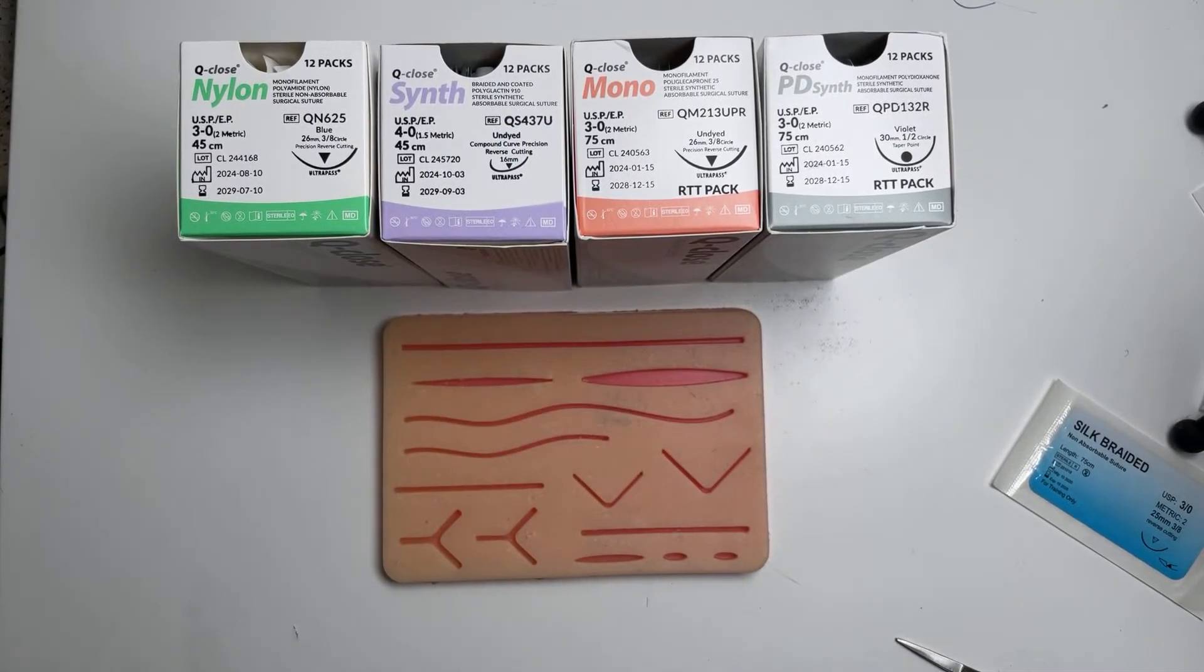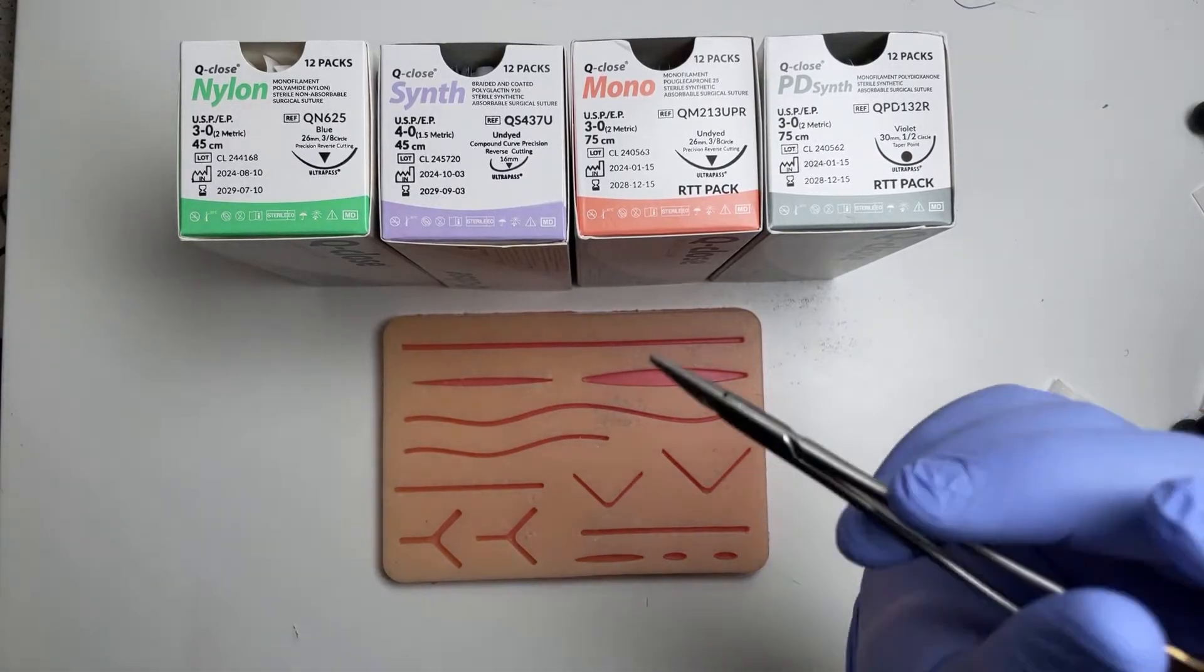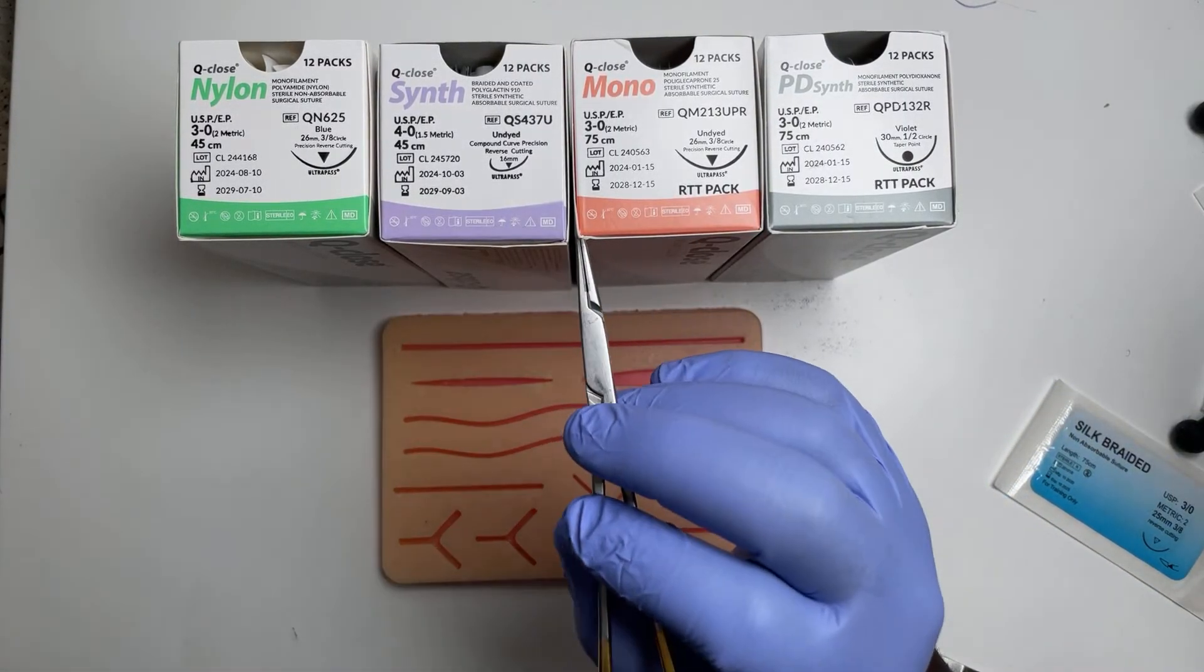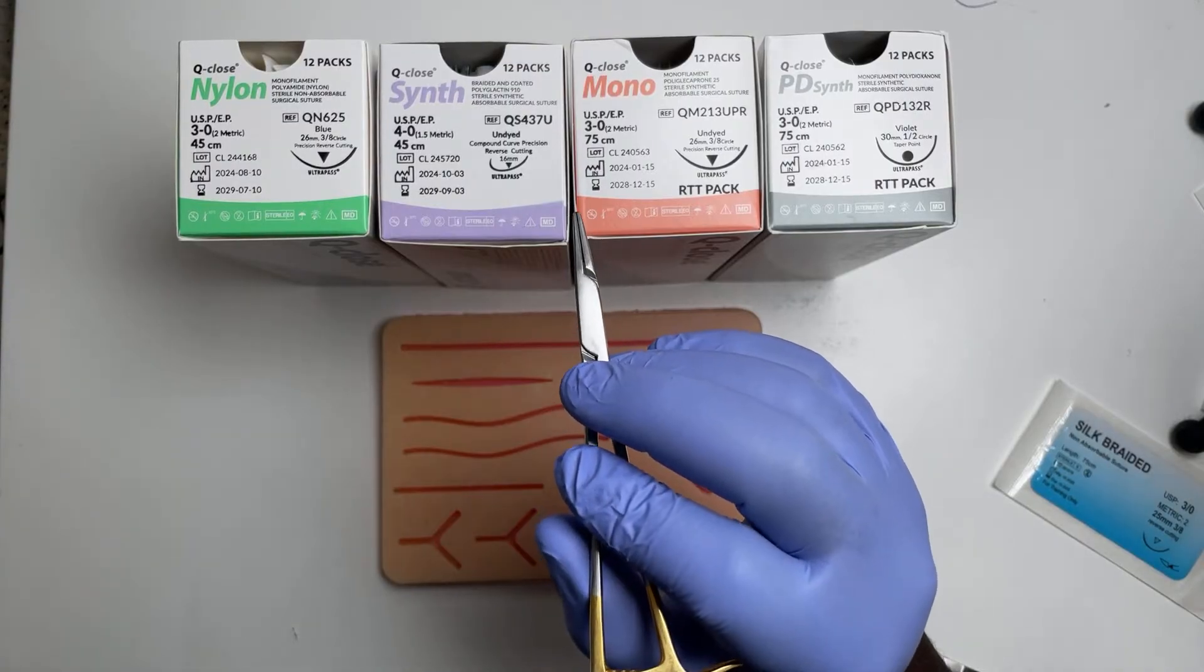Preference depends on the situation. You can use whichever of these you would like, but the key is knowing what you want to do.